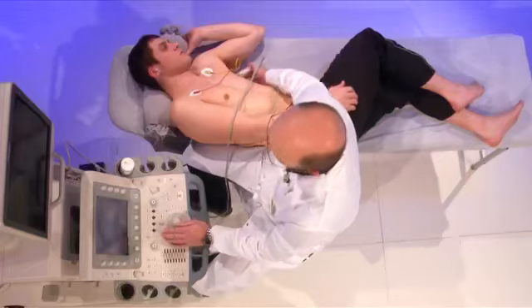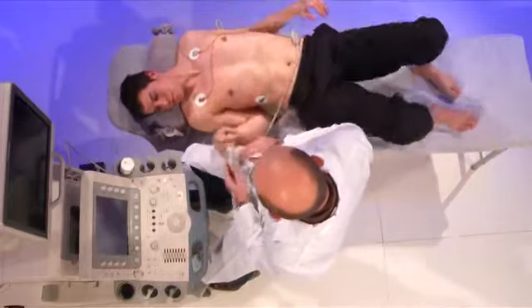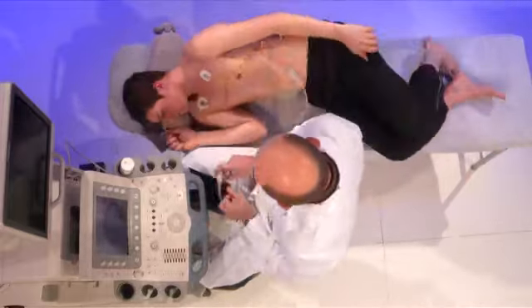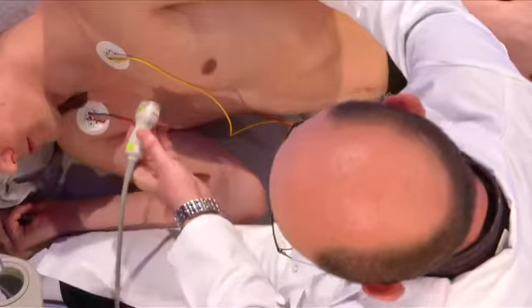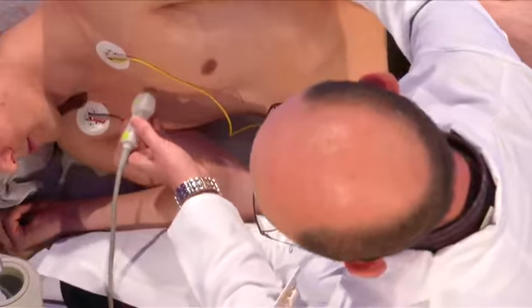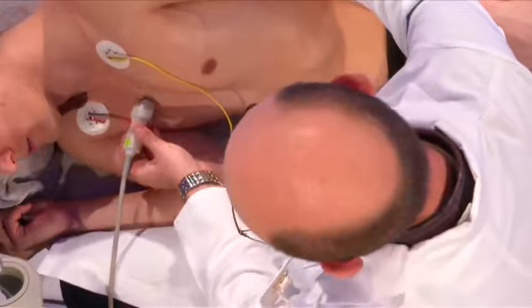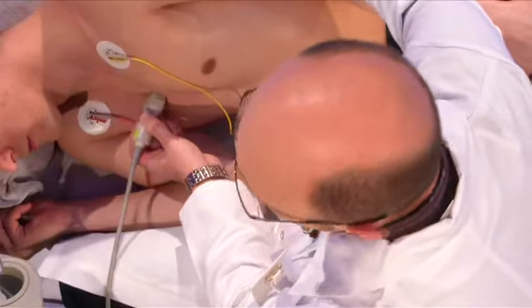Now we will move to the right parasternal view in this patient. The right parasternal view is very useful to image the aortic root and to record the peak velocities in case of aortic stenosis. The position of the probe is with the same axis as compared to the parasternal longitudinal view, but on the right side of the sternum.